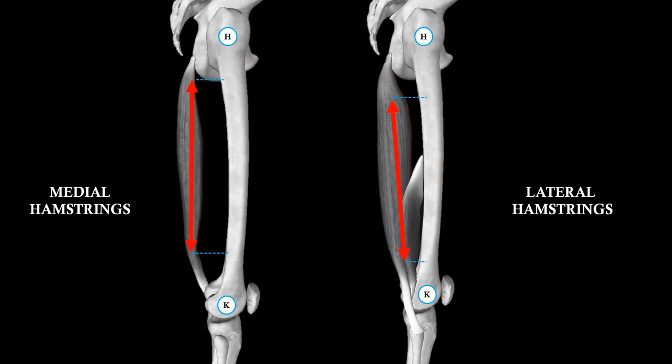We can record for a significant amount of time, and as long as necessary, and we are able to reproduce the testing very easily. Doesn't take long. You just literally have to apply the sensor again, perform the same movement, and we can reproduce the methodology that we've used. So it's easily reproducible.